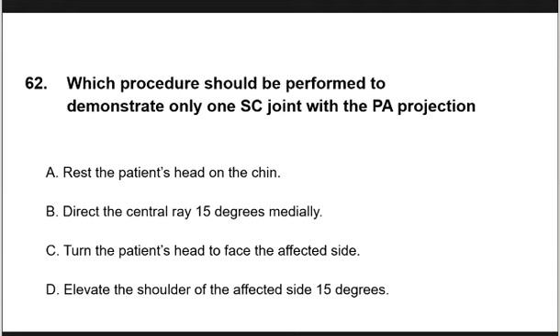So kung isa lang i-demonstrate natin, anong procedure ang piniperform natin? The central ray should be directed 15 degrees medially. So kung ang i-demonstrate natin, I repeat, is only one sternoclavicular joint wherein the patient is in prone position, then the central ray should be 15 degrees medially.